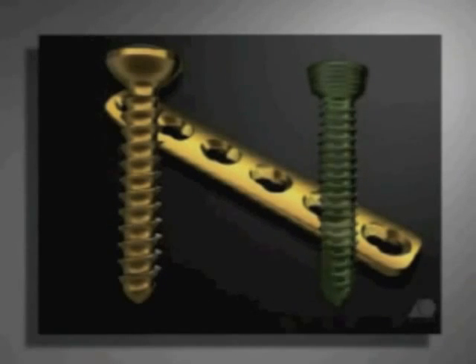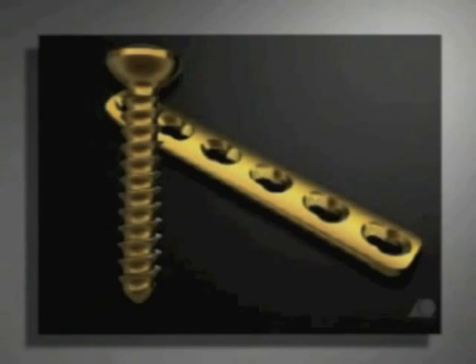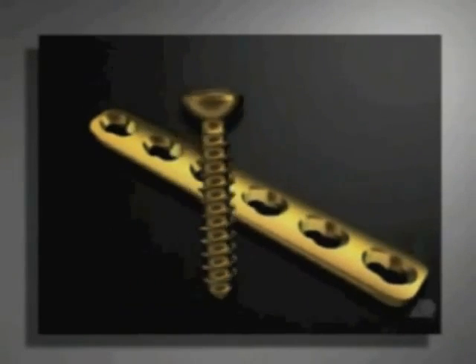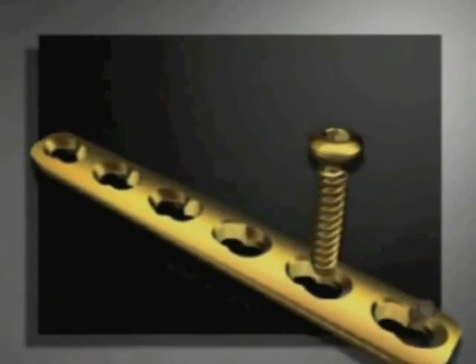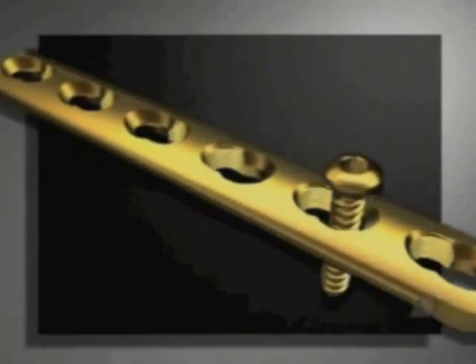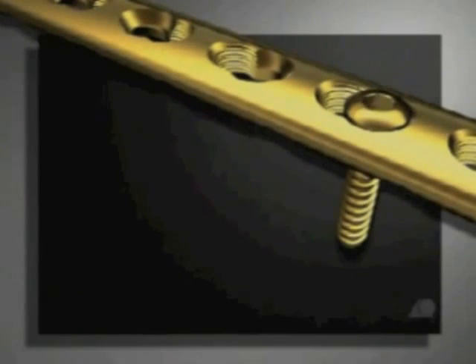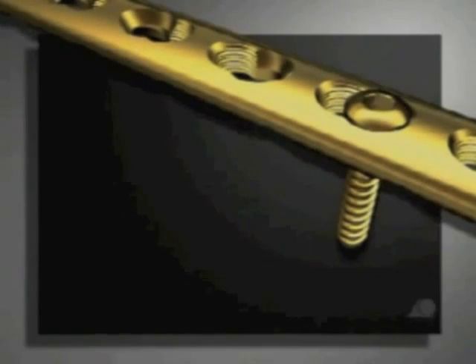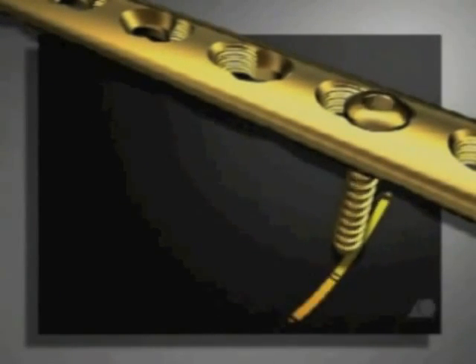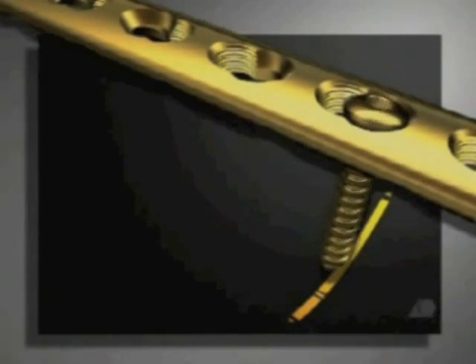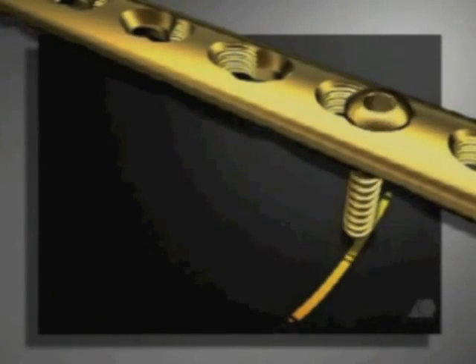The standard 4.5 mm cortex screws are placed in the unthreaded portions of the combination hole, in other words, the dynamic compression unit. Wide angulation of the screws is possible.